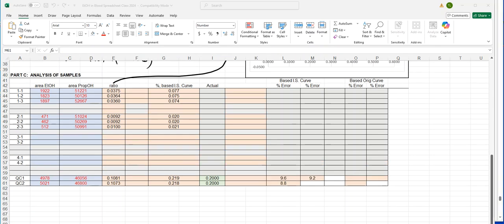Okay, guys, so this is probably our last video, believe it or not, for blood alcohol concentration, or BAC. We are almost at the last leg of the spreadsheet.